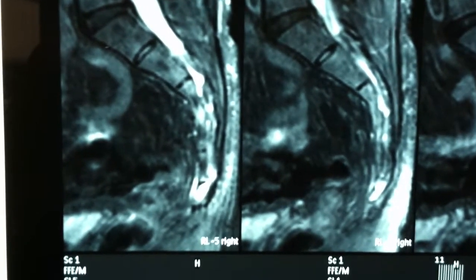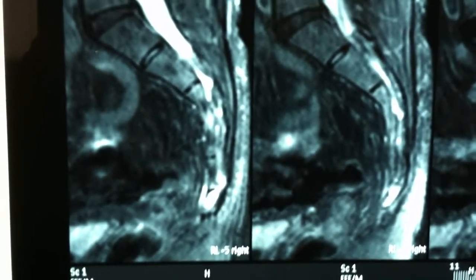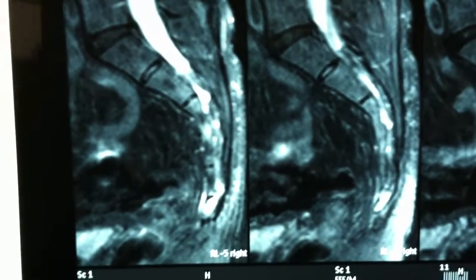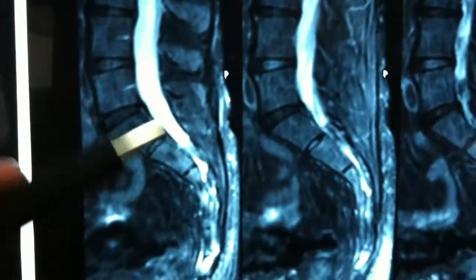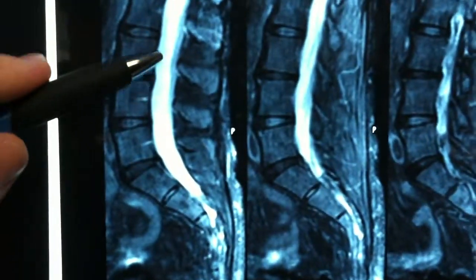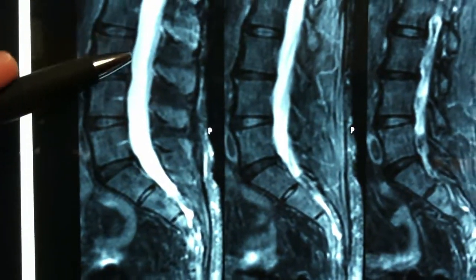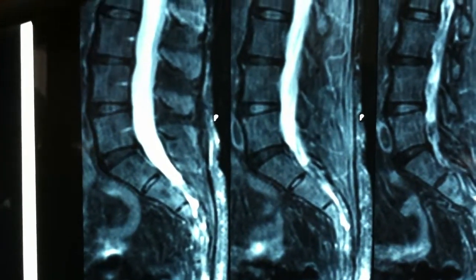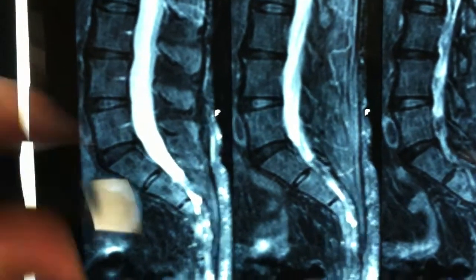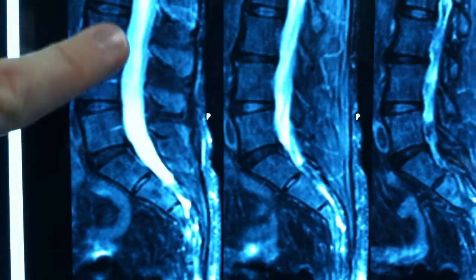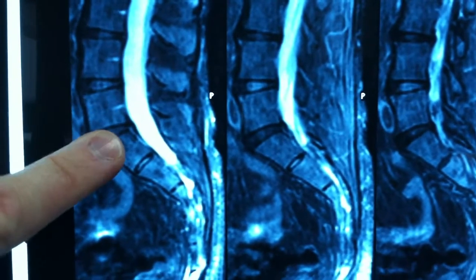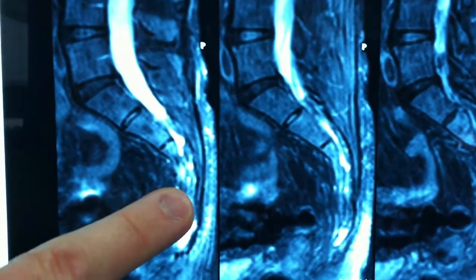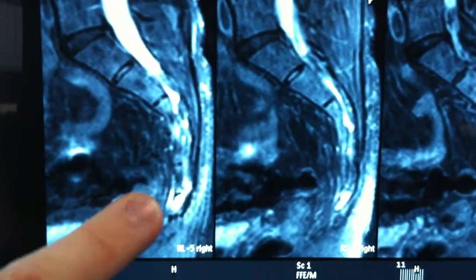This is just a short video showing a coccyx fracture. Here we see the lumbar spine — this is on an MRI study. The lumbar spine is up in this area, and the sacrum is here.